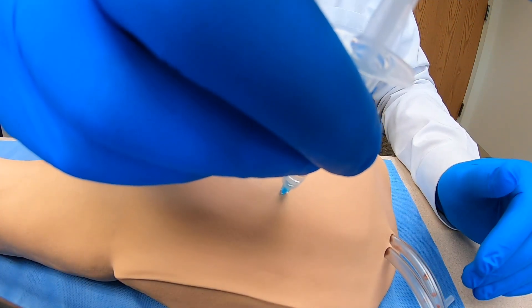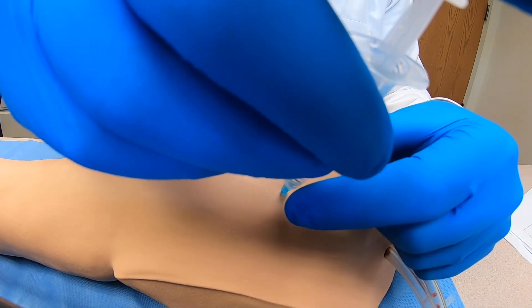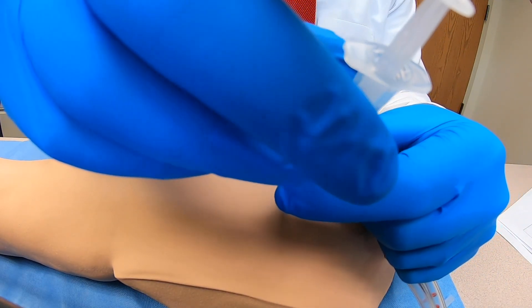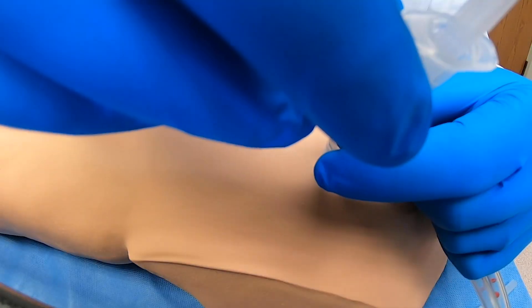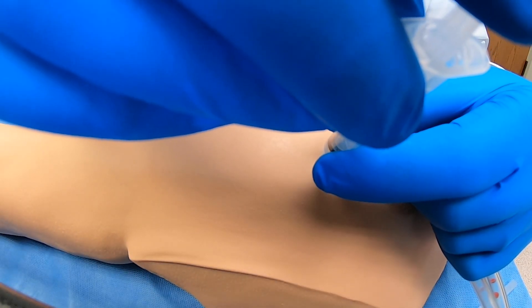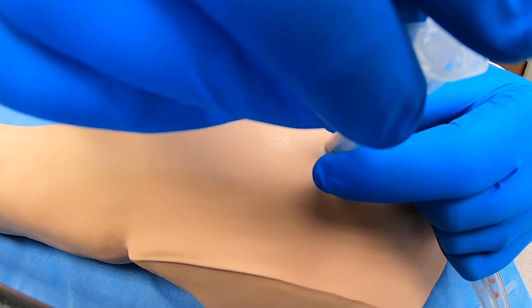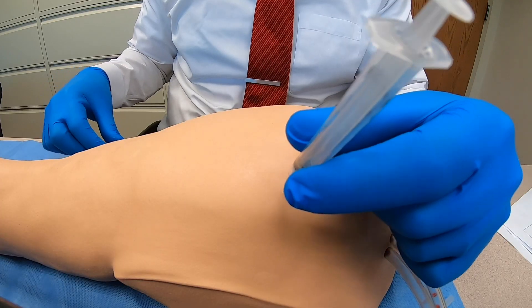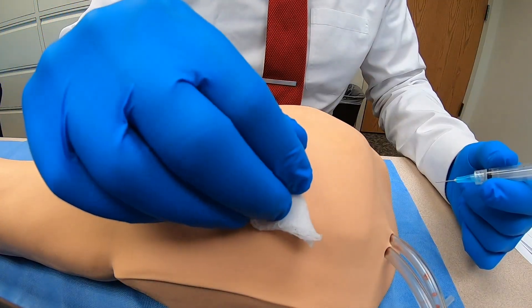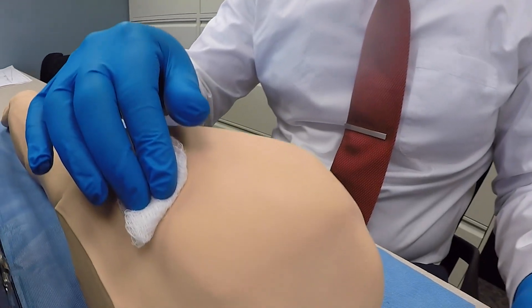Release the tissue prior to injection and steady the syringe with your non-dominant hand at the lower end of the syringe. Inject the medication slowly at a rate of 10 seconds per milliliter and withdraw the needle at the same angle it was inserted. Use a clean gauze or dry cotton wool ball to apply gentle pressure.